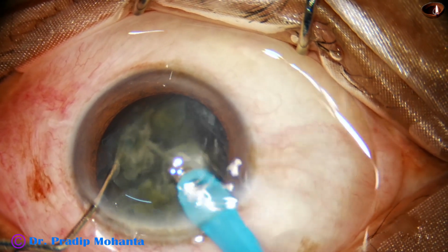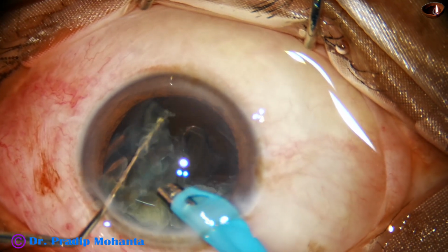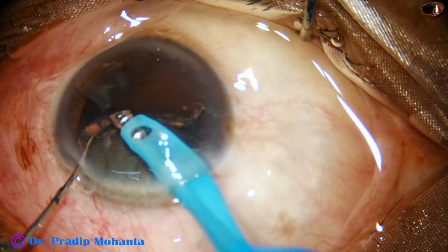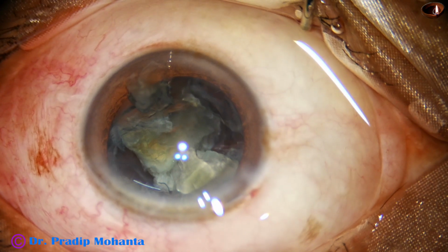At this time I have some doubt something has happened, and here I see a huge rent. So the vitreous has not come into the anterior chamber yet. I probably should not have come out like this anyway. I have to manage it with anterior vitrectomy and place the lens in the sulcus.